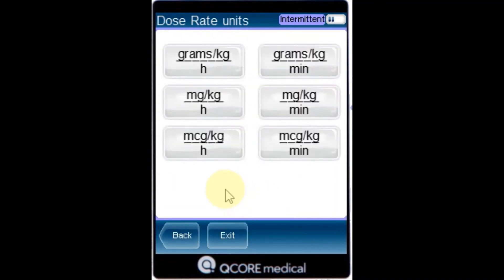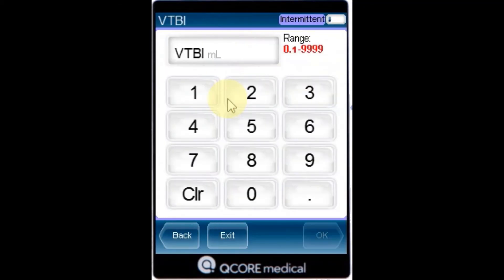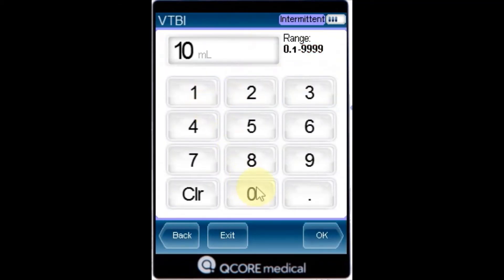From the dose rate unit screen, select the appropriate dose rate units. Using the keypad, enter the VTBI value, then press OK.